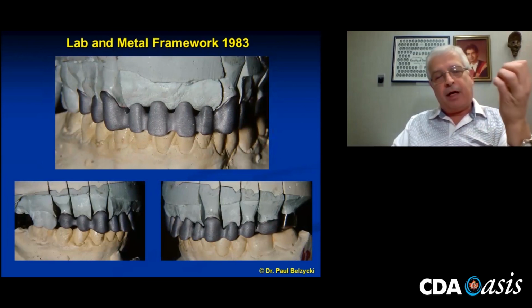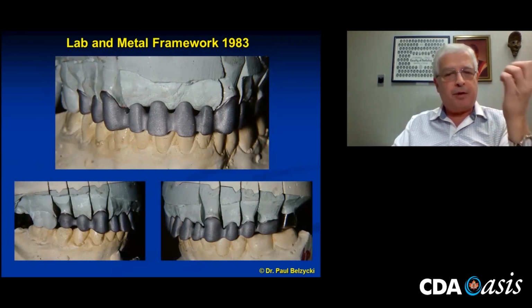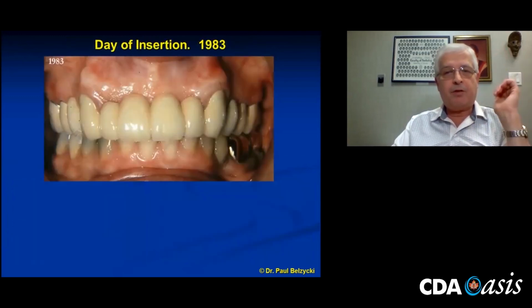This is a case where I got everything back in sections, working with an expert craftsman, Gabriel Pintos, who I've mentioned before, no longer working, retired. Just a superlative technician. Metal framework that I got in sections, jigged up, etc., etc. I put this case in 1983.